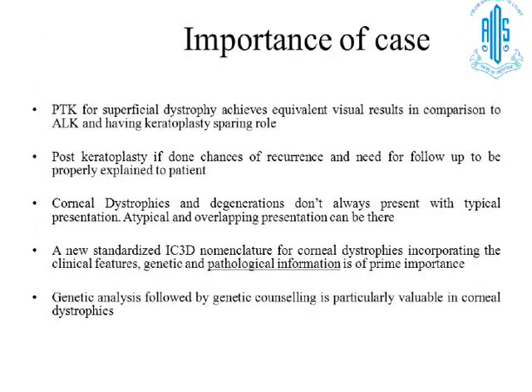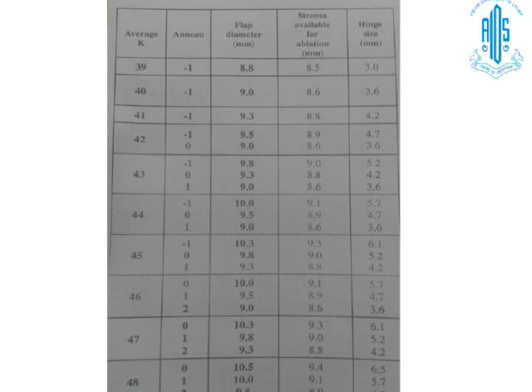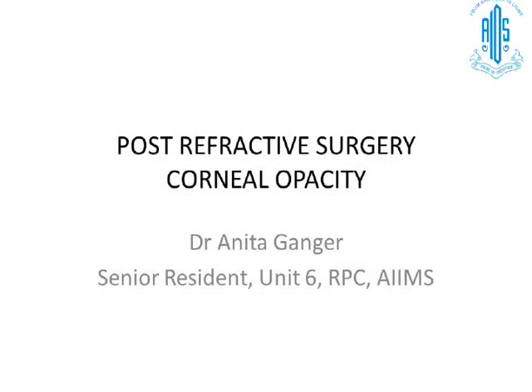So the importance shows that one can do a combination of treatment, and as Srilata showed you, when you're using automated keratome, you have to make use of the nomogram to try and determine the exact diameter of the cut as well as the depth of the cut that you have.